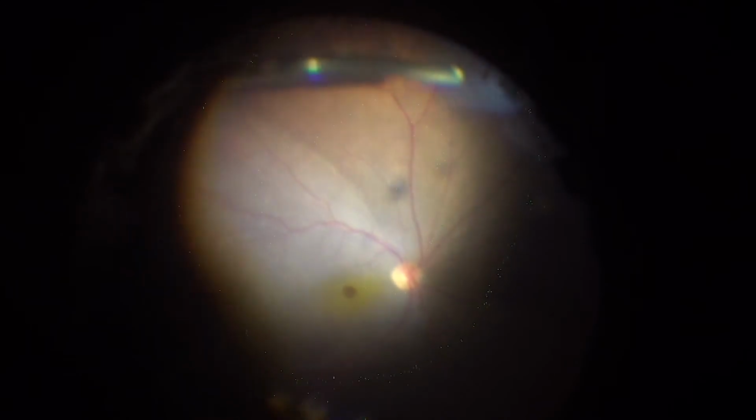We apply endocautery along the supratemporal site for harvesting and procuring a retinal autograft. A combination of intraocular forceps and scissors is used to obtain a free retinal flap for filling the macular hole. We keep the retinal autograft on the nasal retinal side, and use passive suction and fluid air exchange to remove the subretinal fluid, using the harvest site as a draining retinotomy.